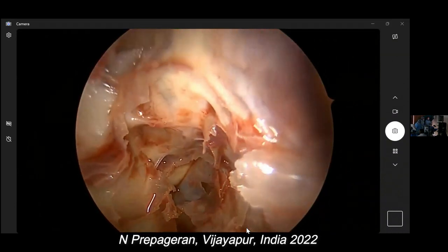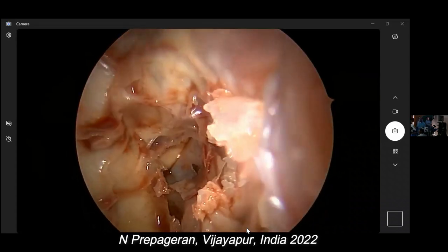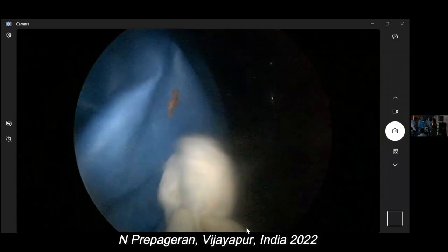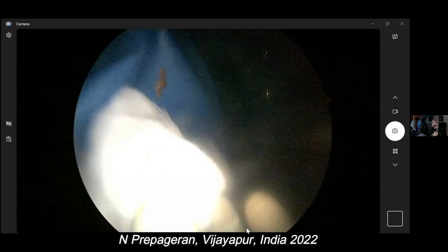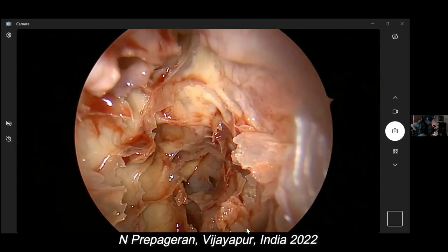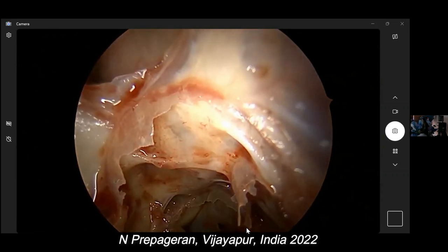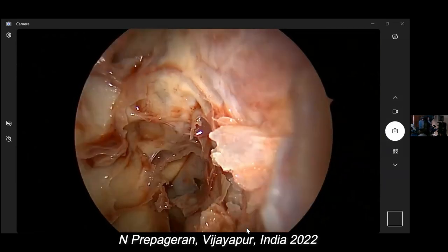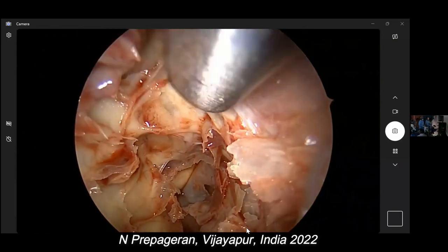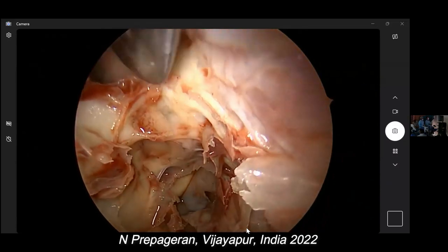There, can you guys see that? So that's your frontal recess up there. Yes, sir. And that's the anterior ethmoidal artery up there. It's in the skull base. Can you show with the instrument, sir, the anterior ethmoidal? It is here. It's inside this. There. Yes, sir. Okay. So it's not on a mesentery. And there's the frontal recess. And there's the frontal up there.